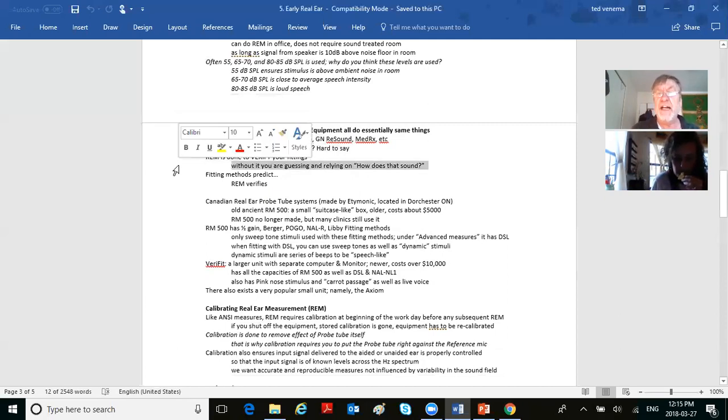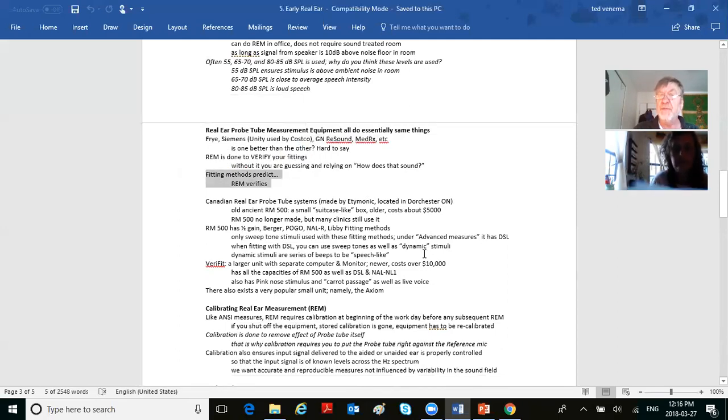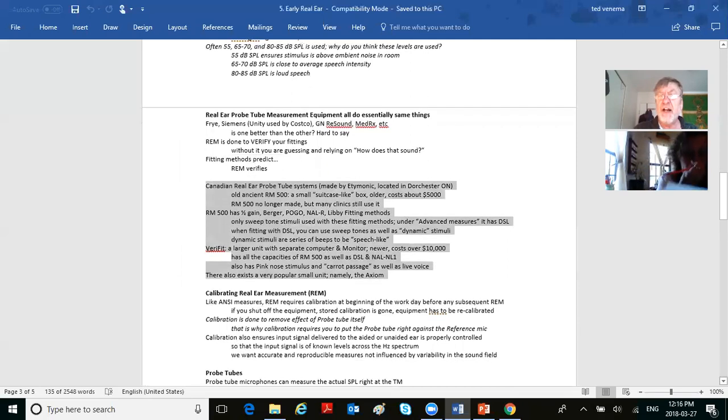Without it, you're sitting there guessing and relying. How does that sound? And here it says, fitting methods predict, real ear measurement verifies. Okay? And then this is just talking about AudioScan instrumentation. You don't need to memorize that, but you should have an idea.